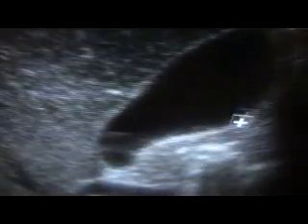This is the gallbladder, the spear-shaped area with its landmark at right angles to its neck, which is the portal vein. We have already discussed that this is the anterior wall of the gallbladder, this is the fundus, this is the neck, and it's clear internally.